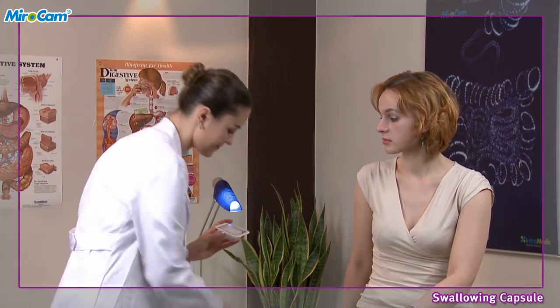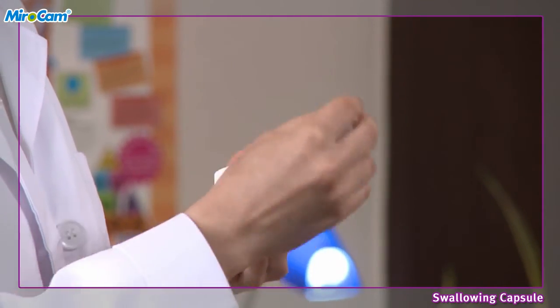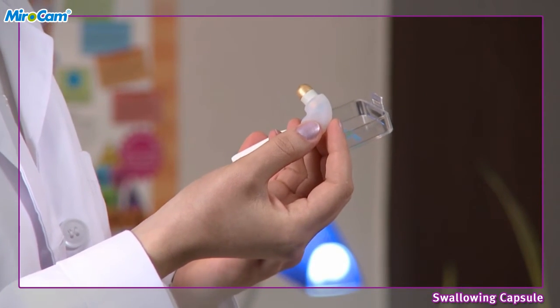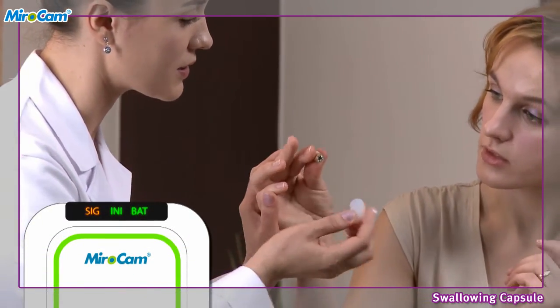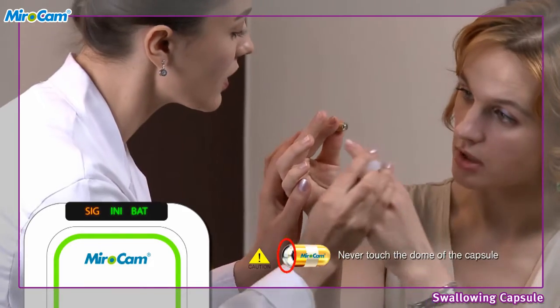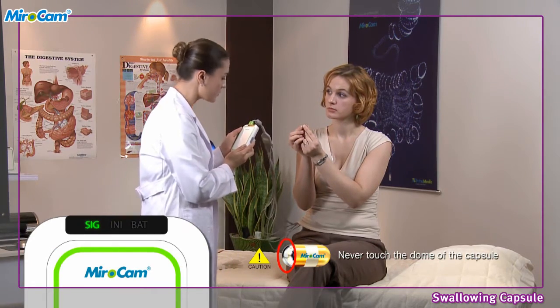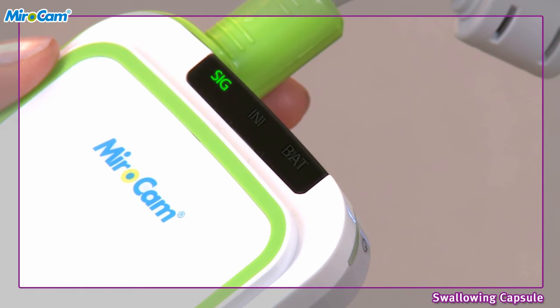Swallowing of capsule. Open the capsule packaging and take the capsule out of the case by the opaque plastic capsule holder. Check to see if the capsule light is flashing. Instruct the patient to hold the capsule by the gold bands between the forefinger and thumb of both hands. After the patient grasps the capsule, check if the signal indicator on the receiver is green. Ensure the indicator is green prior to ingesting the capsule.